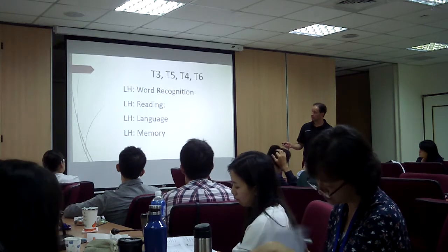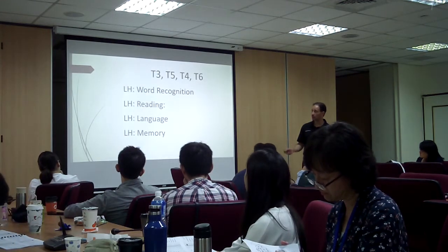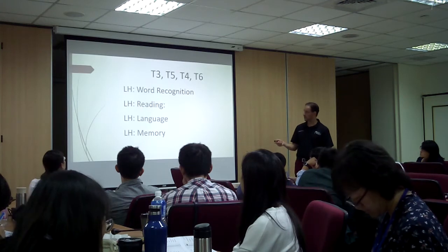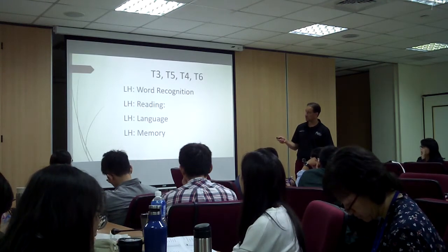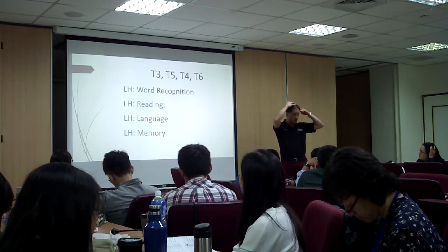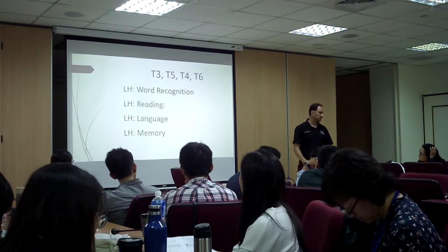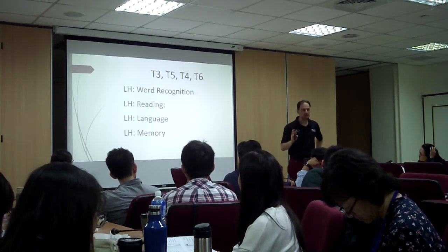So for the temporal lobes, again, the left side is memory and language. So if you have problems producing words or understanding words, the left side of the brain, T3, T5 is a good place to train. Anything that's verbally related, T3, T5. And you can use Cz to T3, Cz to T5, or T3 to T5. You can do one channel or two channel training. Bipolar, monopolar, montage. It, again, depends on the client.